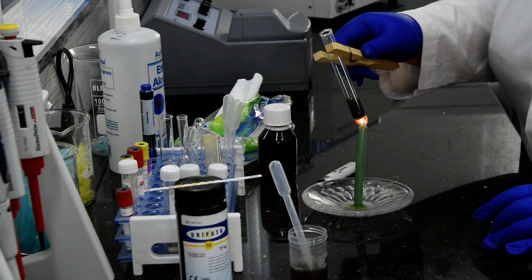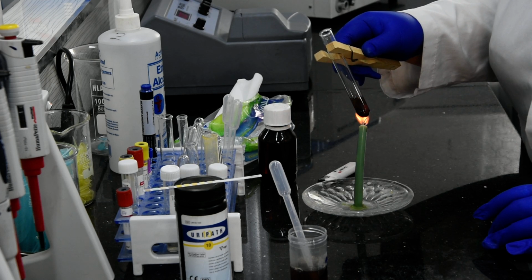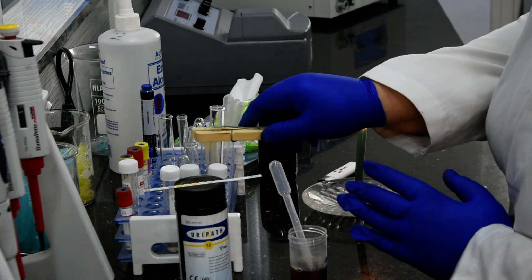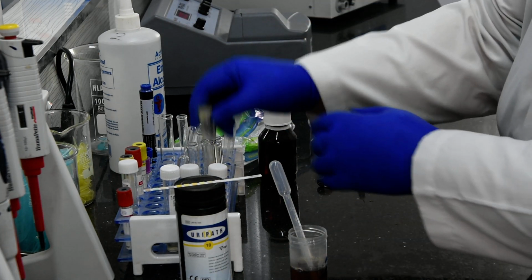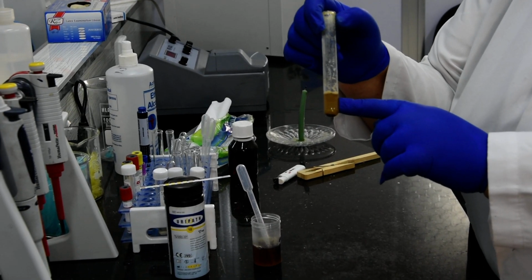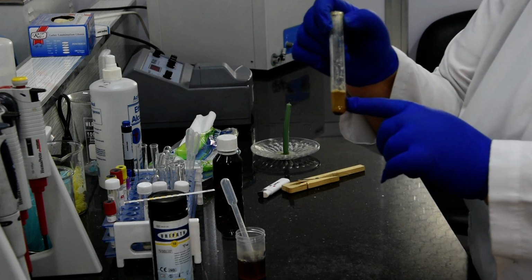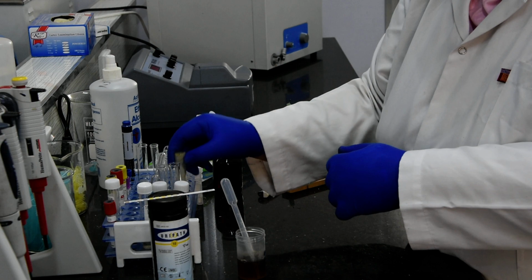You see this? Okay, it's boiling, let it cool. See the tube: turbidity or cloudiness means the urine has phosphate or protein. Phosphate or protein.